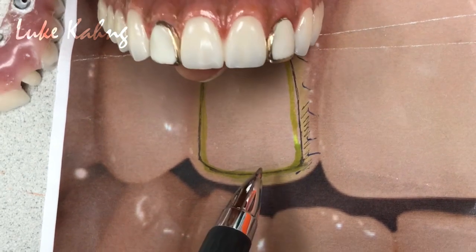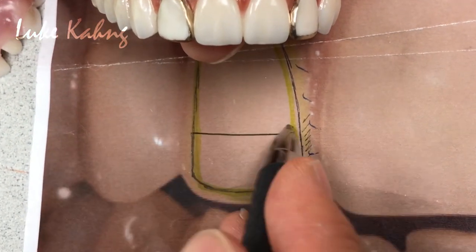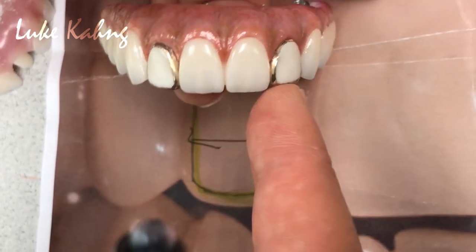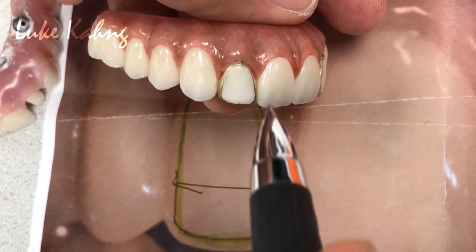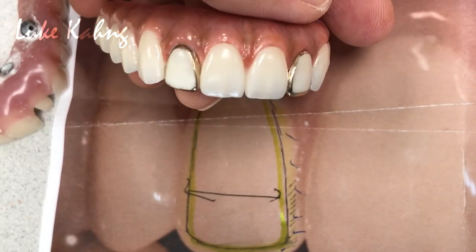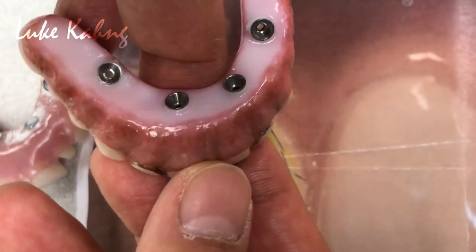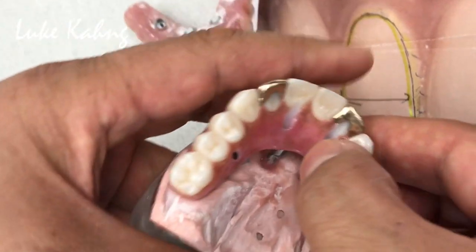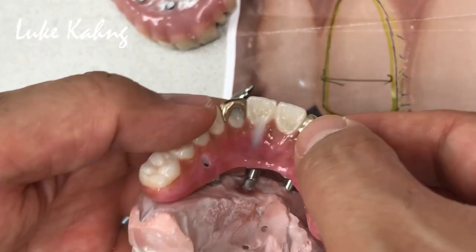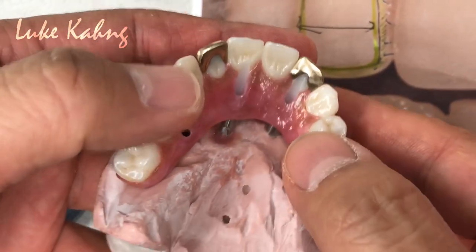The doctor sent the picture, which is that much thickness. This one is too narrow, but that one is a little bit larger. So we're trying to mimic that idea as much as possible. And then finally we finish it and cement it both here and there. Right? So here's a lingual part, kind of a very unique case, which is patient one.